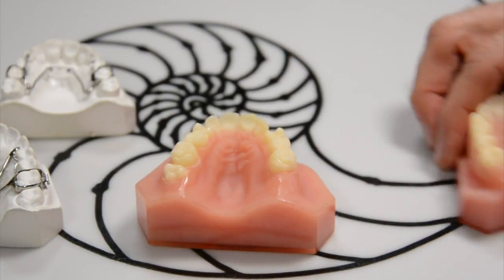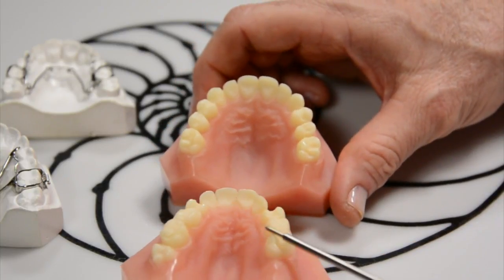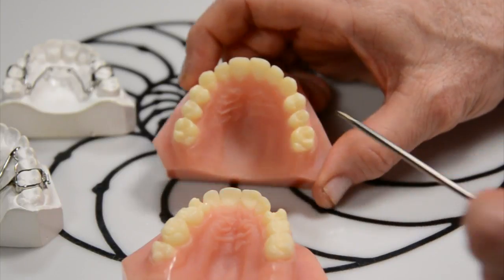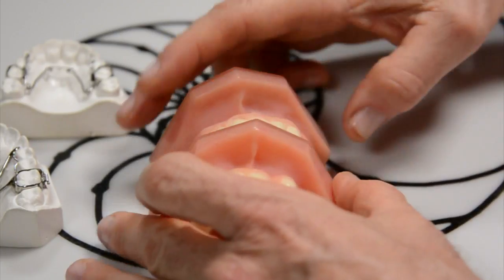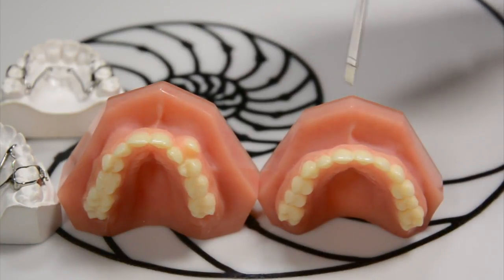And this is what he looks like afterwards. He went from completely crowded with a blocked-out tooth to this right here, where all the teeth are in — nice and broad. And from the front angle, it went from here to here.